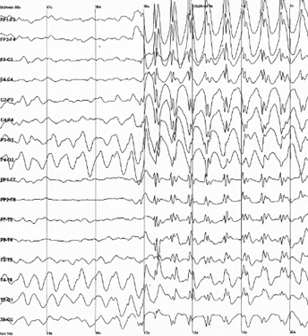The EEG is read by a clinical neurophysiologist or neurologist, depending on local custom and law regarding medical specialities, optimally one who has specific training in the interpretation of EEGs for clinical purposes. This is done by visual inspection of the waveforms, called graphoelements. The use of computer signal processing of the EEG, so-called quantitative electroencephalography, is somewhat controversial when used for clinical purposes, although there are many research uses.